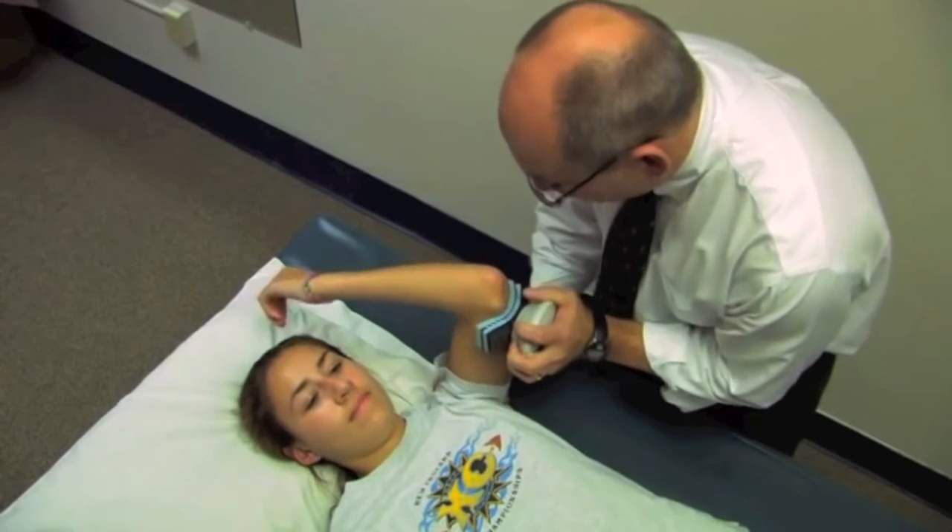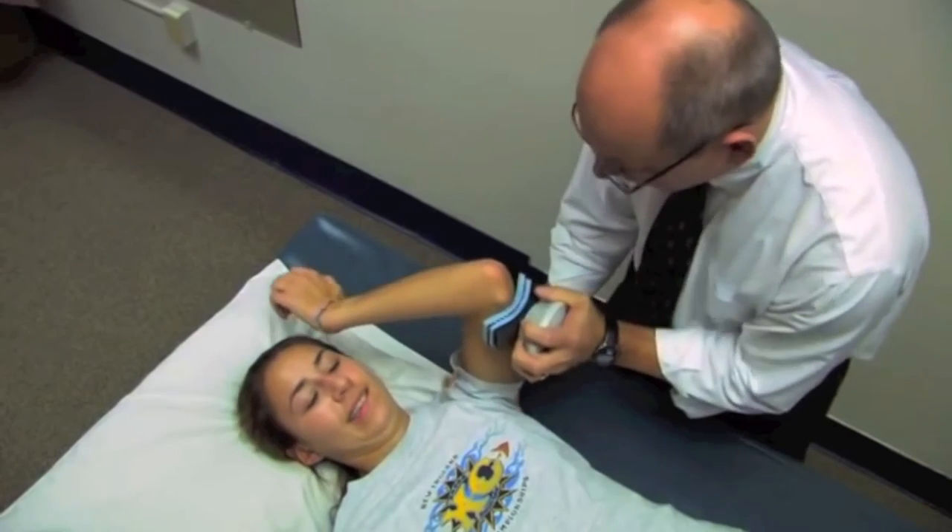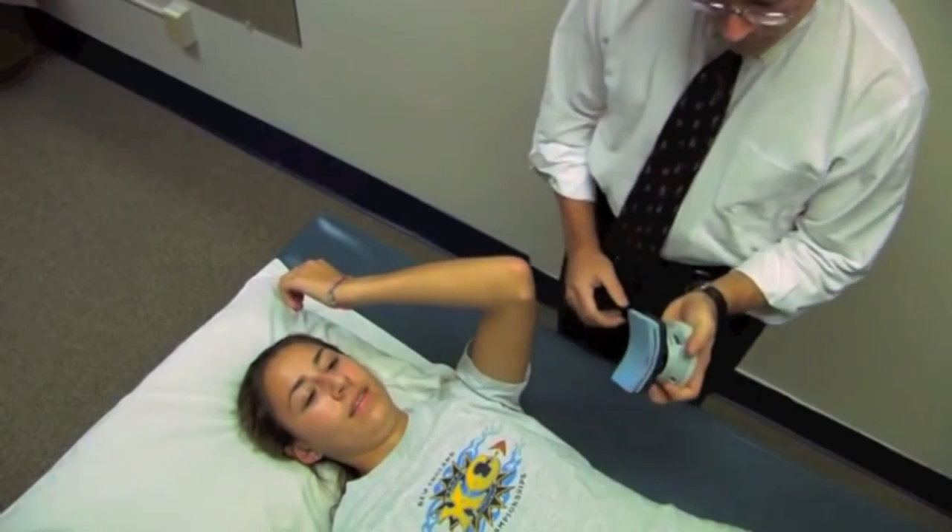Okay, ready, go ahead, go. Harder, harder — and relax. Good job. About 48 pounds.